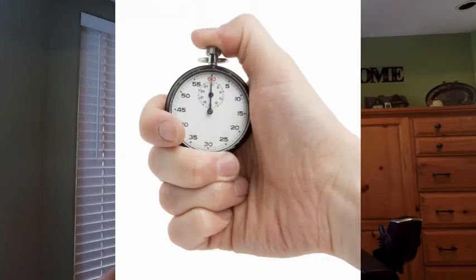New technologies have allowed manufacturers to develop power chairs with elevating seats that can raise or lower while moving at 3.5 miles per hour. Some of the newer chairs can raise or lower the seat 10 inches in as little as 16 seconds compared to the older chairs that took between 45 and 60 seconds and could only be raised when the chair was not moving.